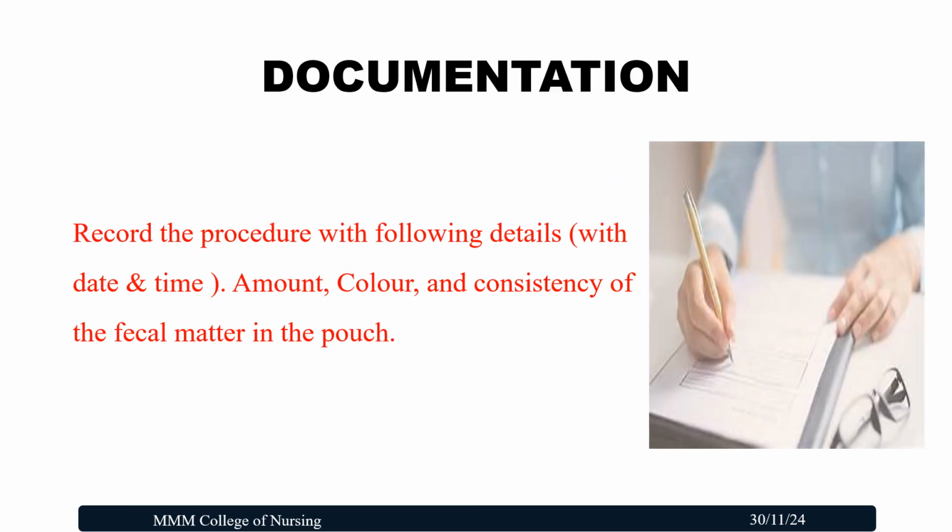And finally, coming to the documentation, record the procedure with the following details: the date and time, amount of the fecal material, color of the fecal material, and consistency of the fecal material in the pouch. All of these we have to document.